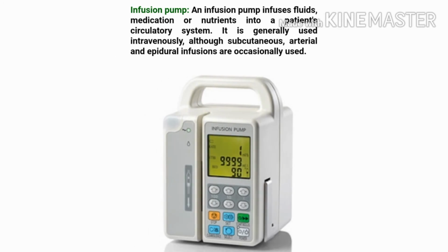So this is our next image, and this is an infusion pump. An infusion pump infuses fluids, medications or nutrients into the patient's circulatory system. It is generally used intravenously, although subcutaneous, arterial and epidural infusions are occasionally used, and this instrument is used in ICUs mostly.